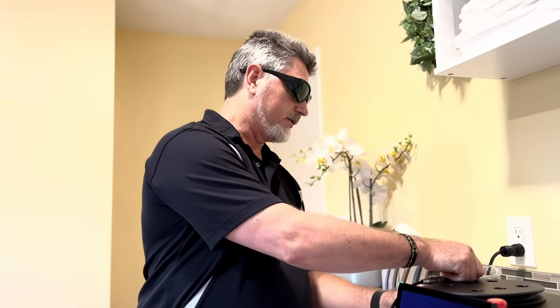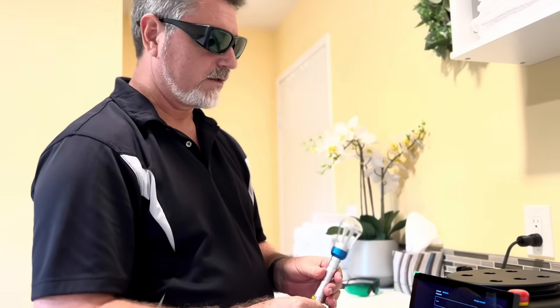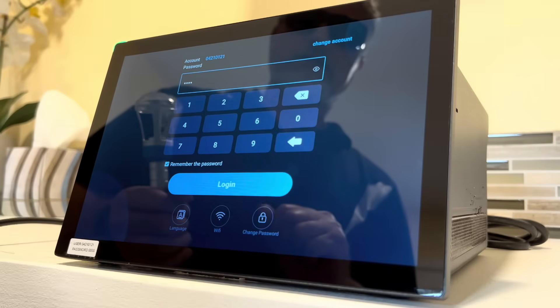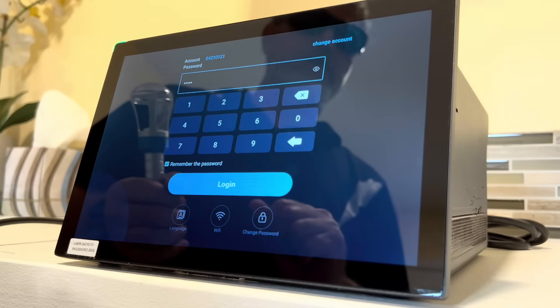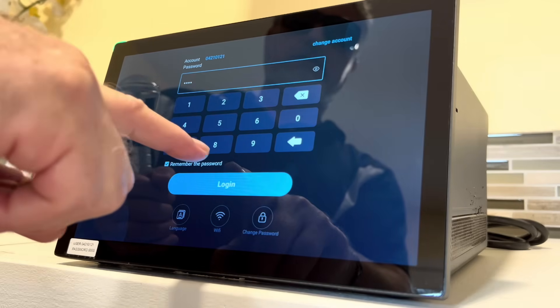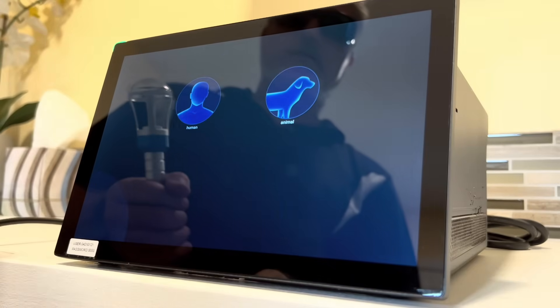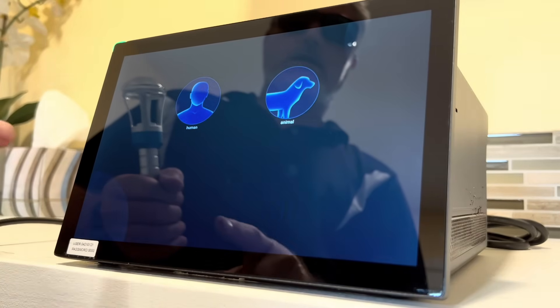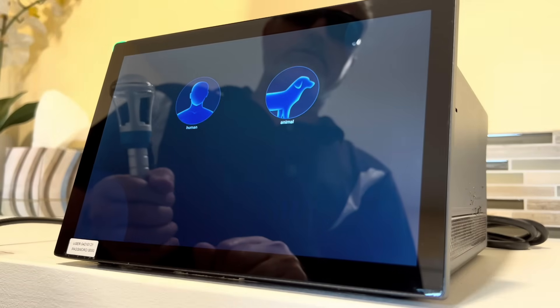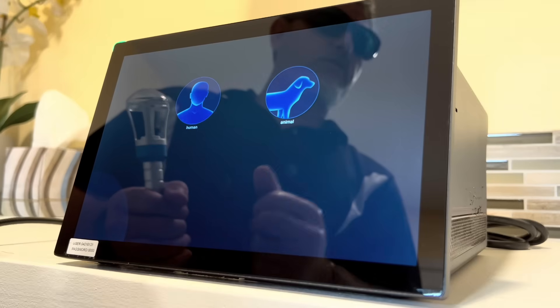We'll take out the handheld emitter — I have the convex cover on here. We have the opening screen; the password has already been entered and it saves it, it remembers the password so you don't have to keep entering it every time. You simply click login.